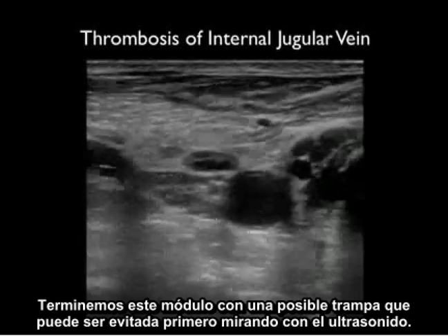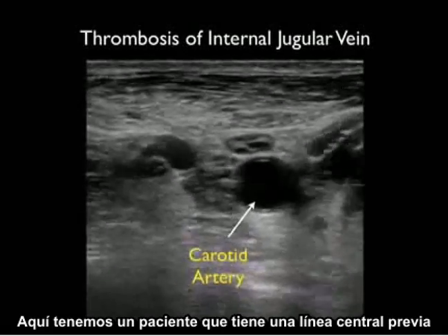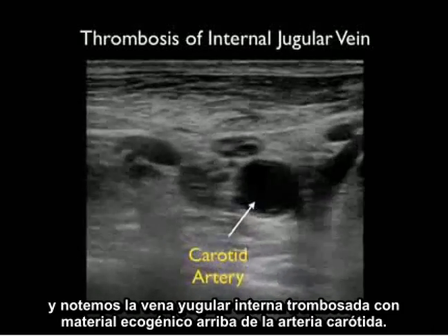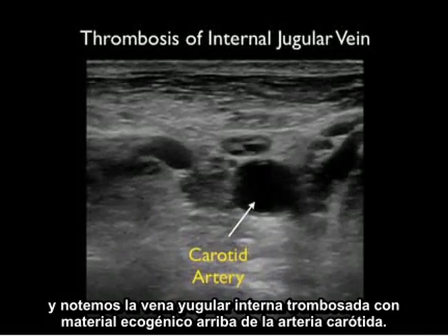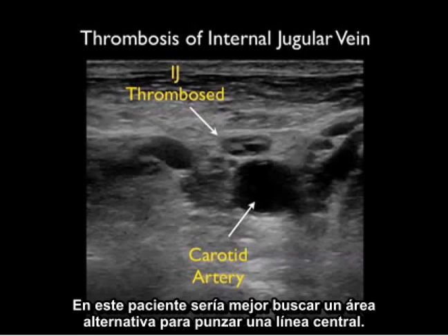Let's end this module with a possible pitfall that can be avoided by first looking with ultrasound. Here we have a patient who's had a prior central line, and we notice a thrombosed internal jugular vein with echogenic material on top of the carotid artery. When we push down with the probe, the internal jugular vein failed to compress. In this patient it would be best to look for an alternative area for puncture of a central line.